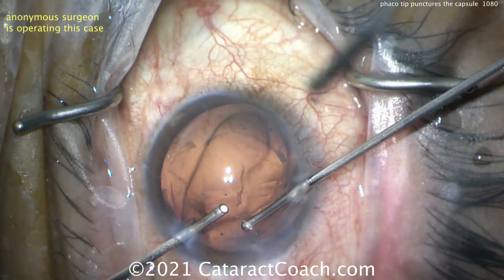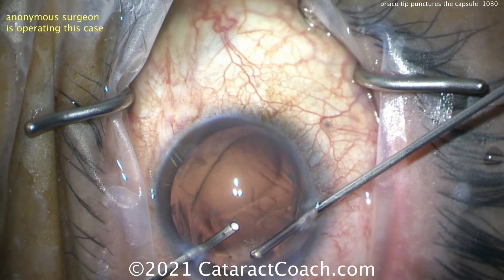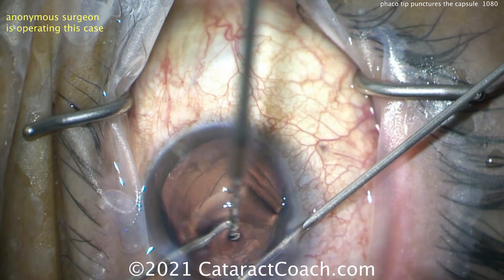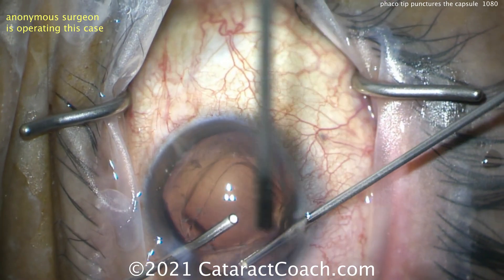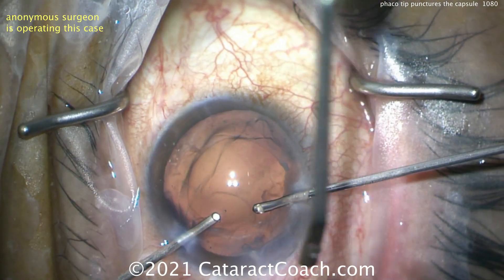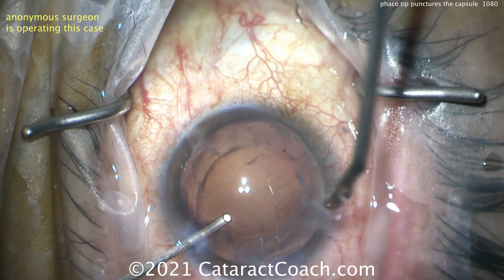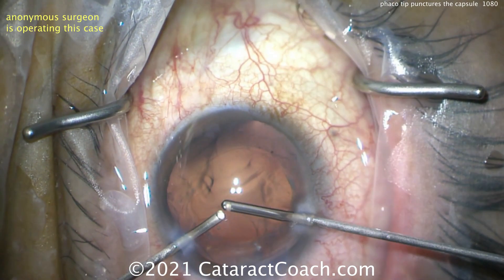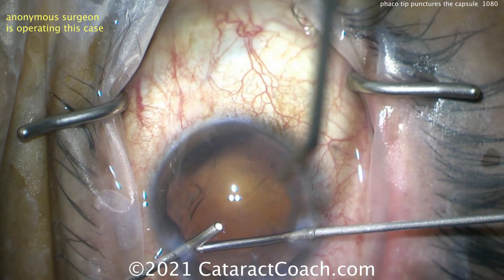The mode we're in is anterior vitrectomy: position one on the pedals is infusion, two is the vitreous cutter, and three is aspiration. You want a very high cut rate — whatever your machine will do, one thousand, two thousand, or even more cuts per minute. Take your time. If you can't tell where the prolapsed vitreous is, put in triamcinolone acetonide to stain the vitreous.